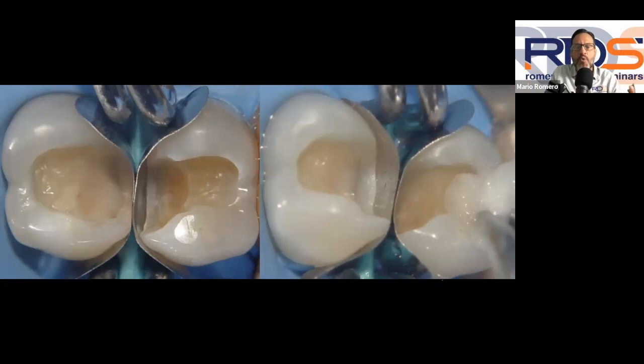And mainly when the lingual buccal width of my proximal boxes is too wide. When they are too wide, it is very hard for me to actually stabilize any of these rings. So I still like using the old version of the Garrison ring, which I still have in my practice. I don't use it as much as I used to because now I'm using a lot more the 3D by Garrison.